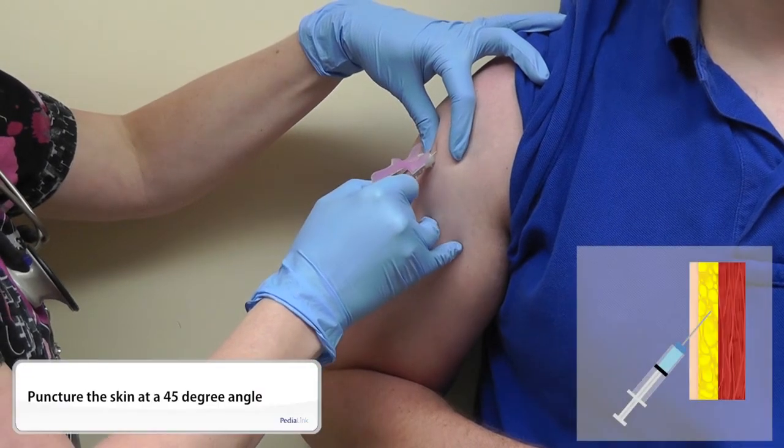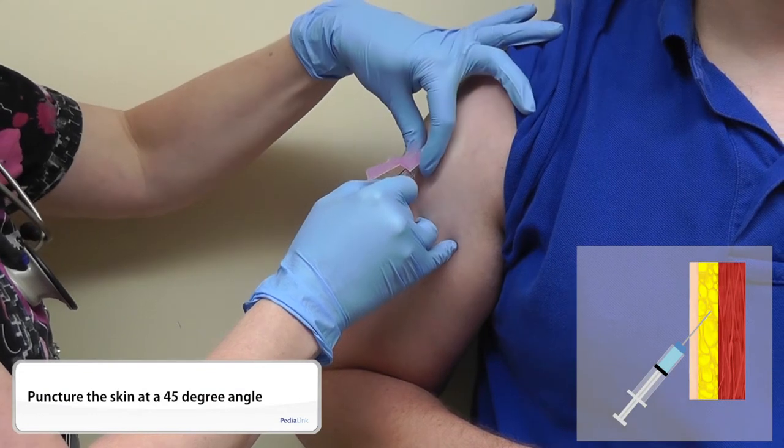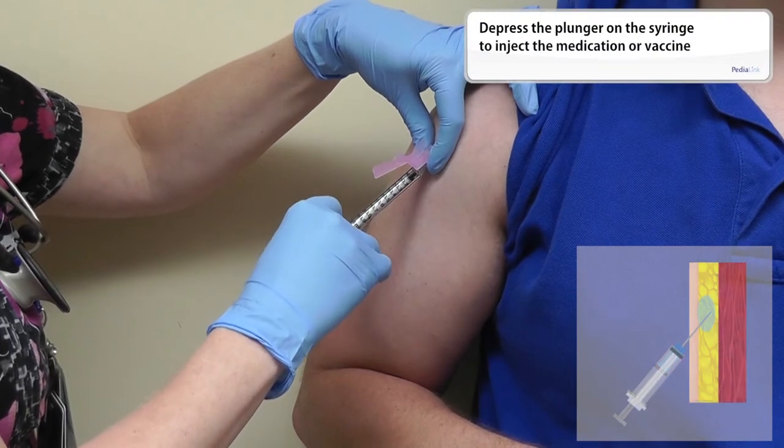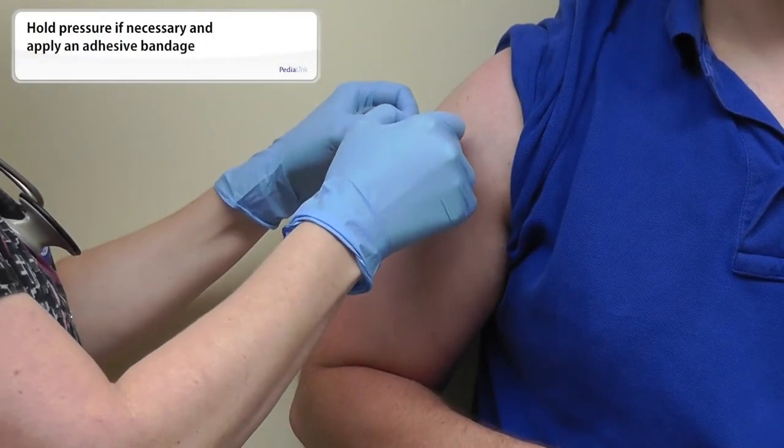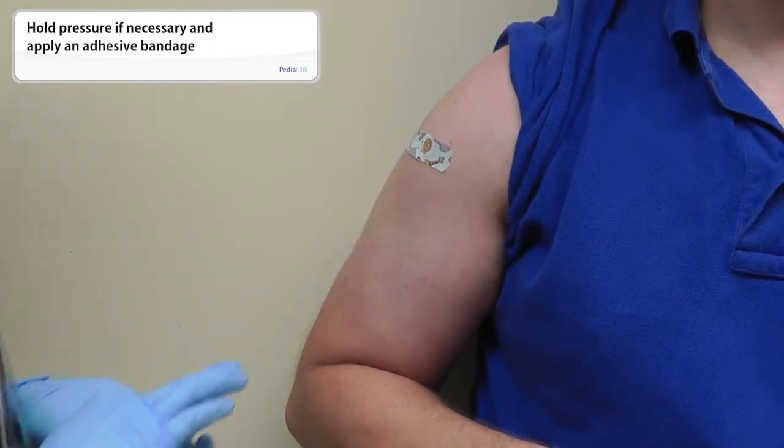Puncture the skin at a 45-degree angle. This way, the shorter needle used in sub-Q injections will not reach the muscle. Depress the plunger of the syringe completely to inject the medication. After removing the needle, you may need to hold pressure with a cotton ball or gauze prior to placing a bandage. After the injection, observe for medication effects.